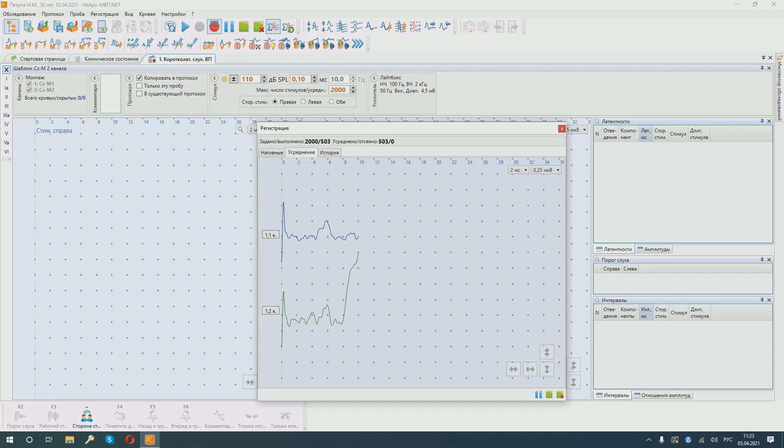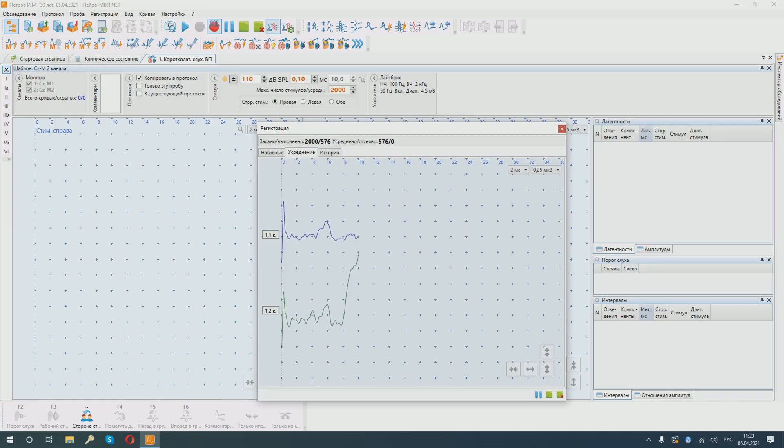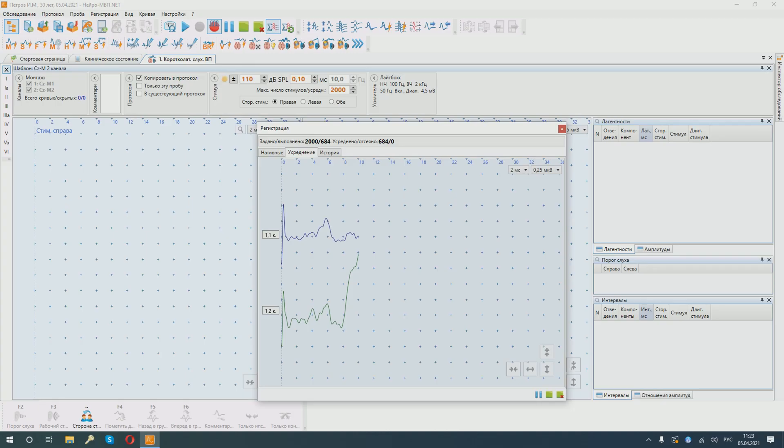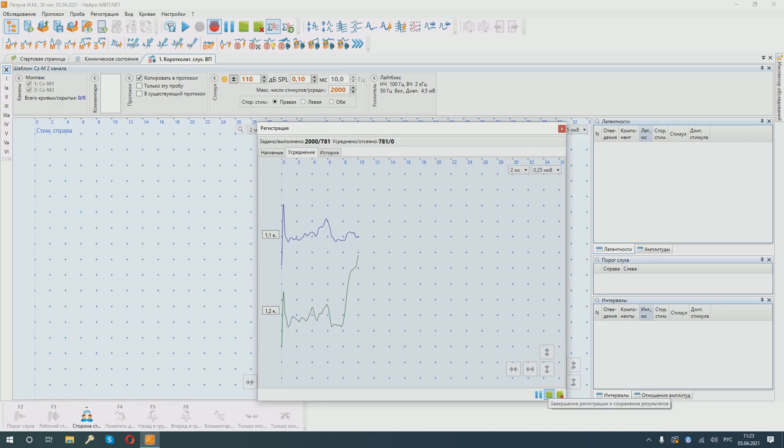We can see the major peaks forming, but in order for us to be sure that this is indeed an electrophysiological response, we will have to run the stimulation cycle two times to make sure that the curves are reproducible. We can see that in general, the main peaks are quite stable. In case we are satisfied with the quality of the response we get, we can terminate the registration early and save the results.